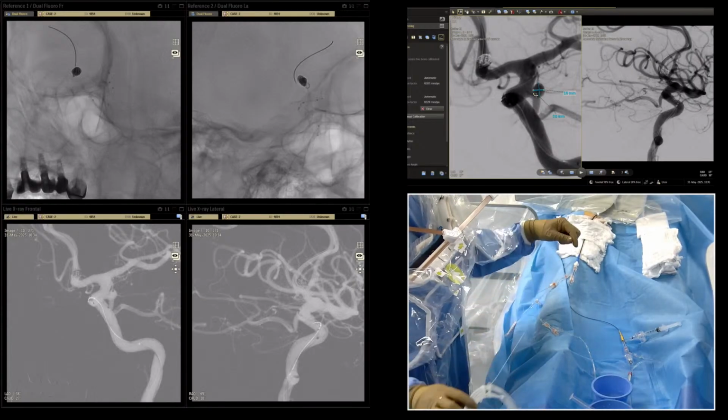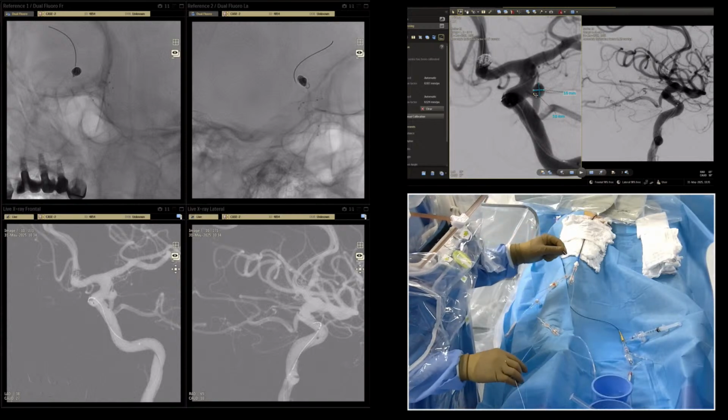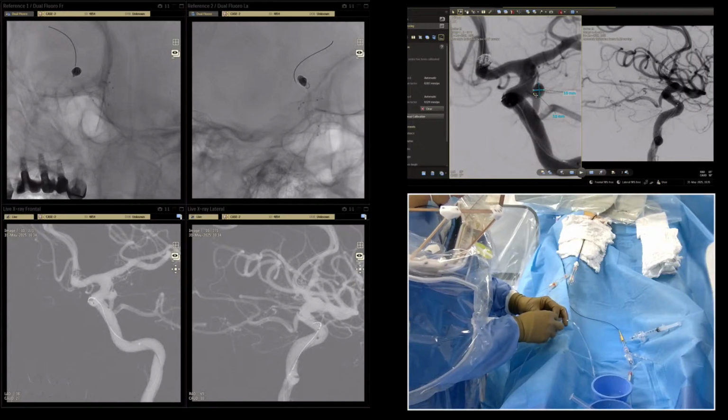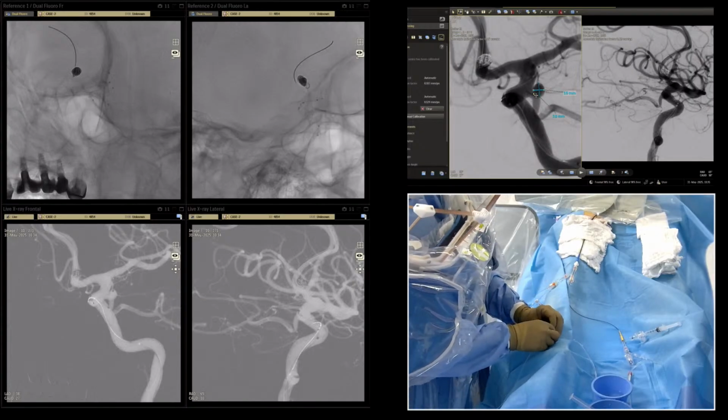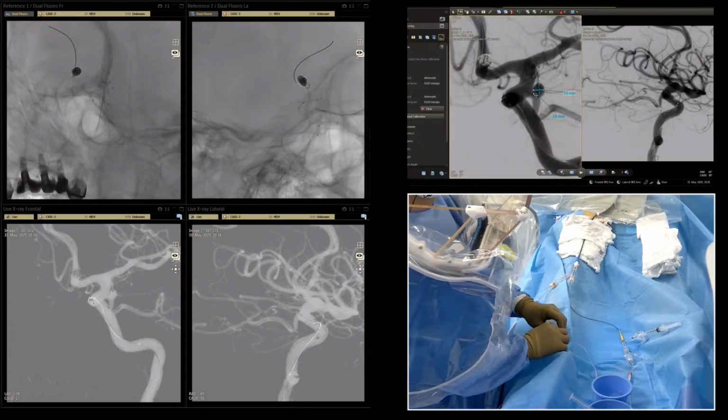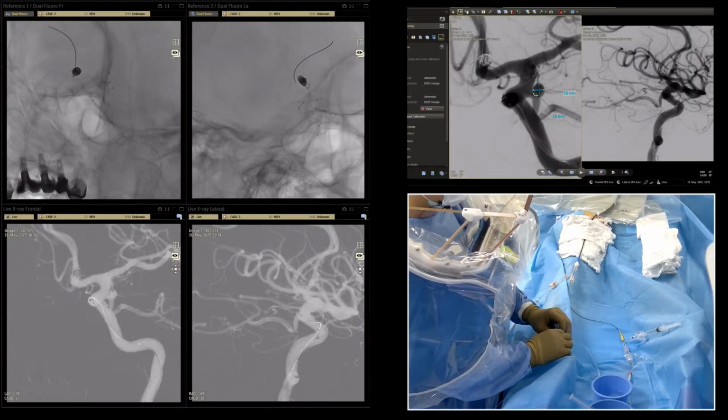Yes, the Rumanero. Could you change this hub? Now you're a different company, and maybe you can do some improvement in this hub.